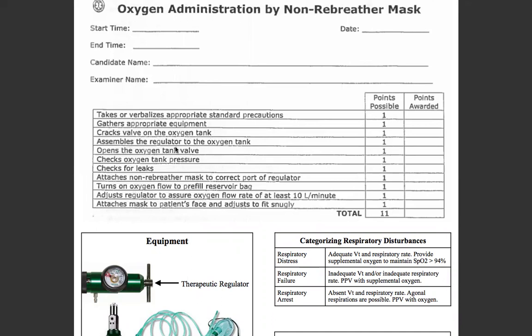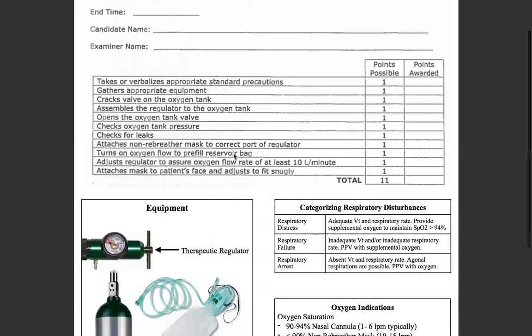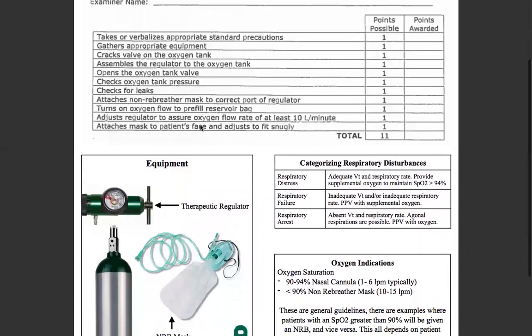Then you will assemble the regulator to the oxygen tank, open the oxygen tank valve, check the tank pressure — make sure it's going to be in the range of maybe 1,000 to 2,000 PSI. That would be ideal. Check for any leaks.